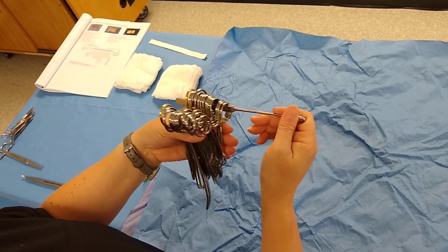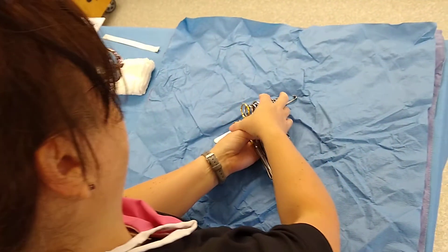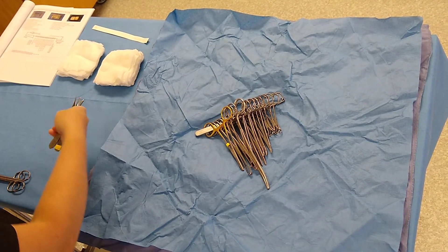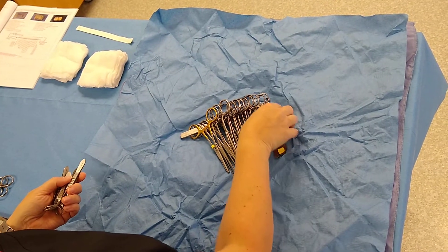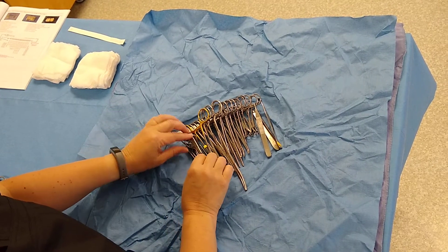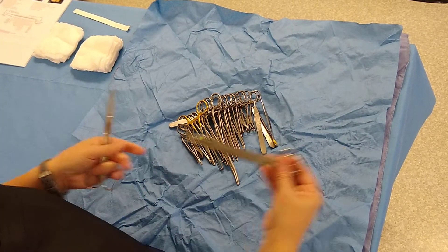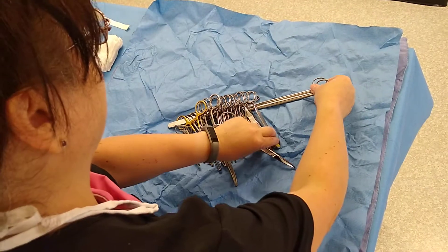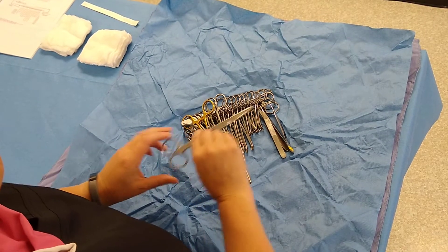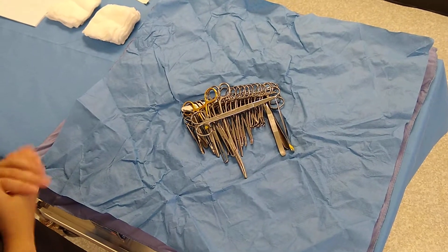Keep your instruments together and place your spay hook inside one of the loops. Place it flat and see how it lays nicely. Your towel clamps and straight instruments come next — see how the tines all point in the same direction, because you have to wrap these without them poking through. Your Metzenbaums are going to slide underneath, and your Metzenbaums or your Mayos go on top. There is your instrument placement — it somewhat forms a little rectangle.